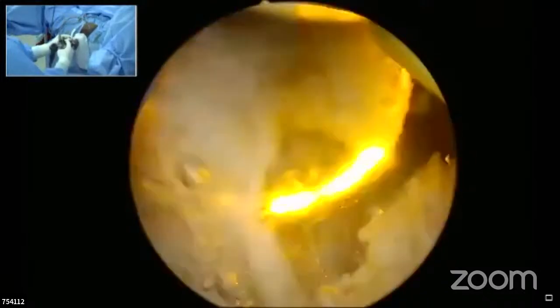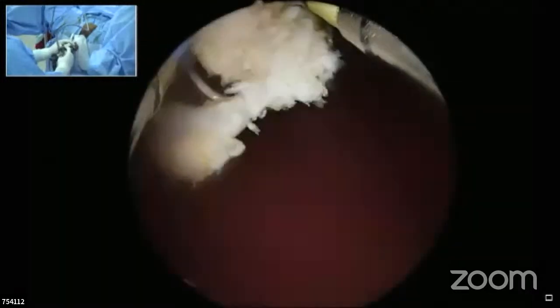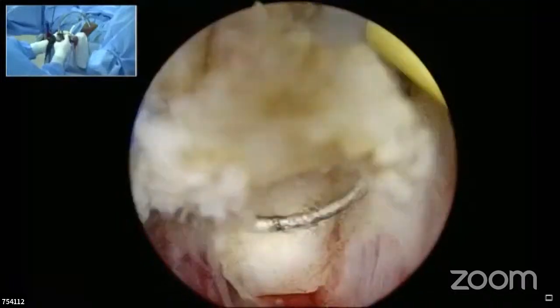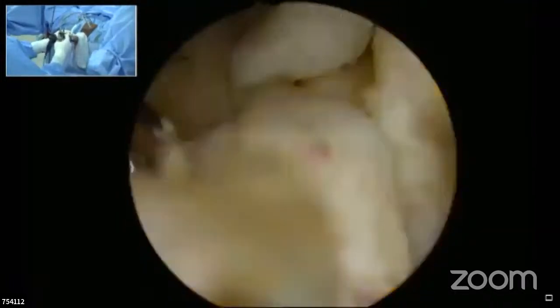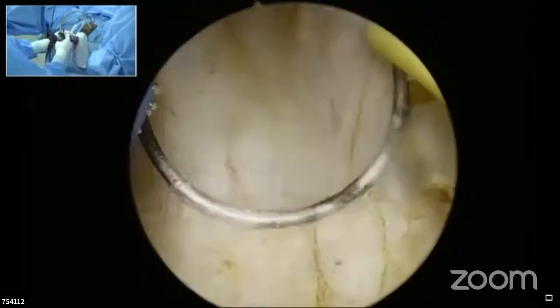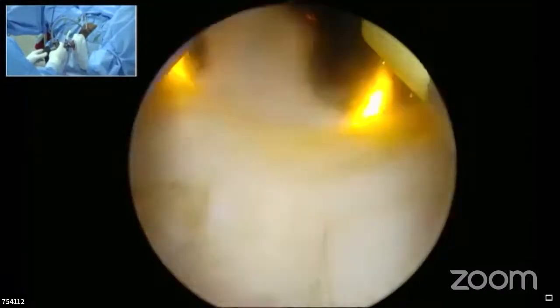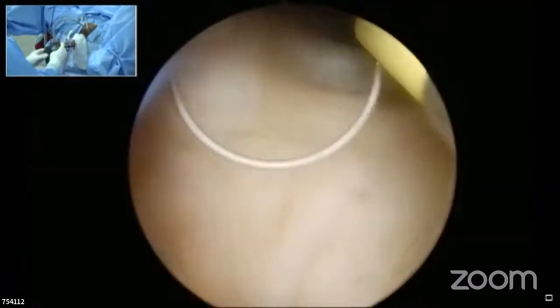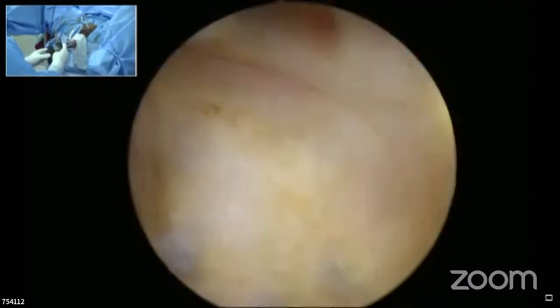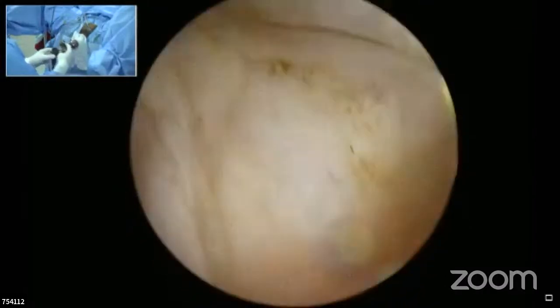The advantages, again, the classical advantages of opening up a channel for clear irrigation, improves the vision. And once we start releasing the lateral lobes with any modifications of the Nesbitt technique that we do, we need a space in the central part of the urethral canal for the lateral glands to fall. So there's still adequate amount of tissue in the median lobe that we can resect later on. So my first task of debulking the median lobe and creating a channel is done.